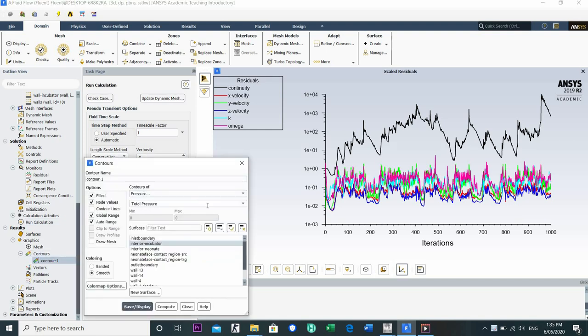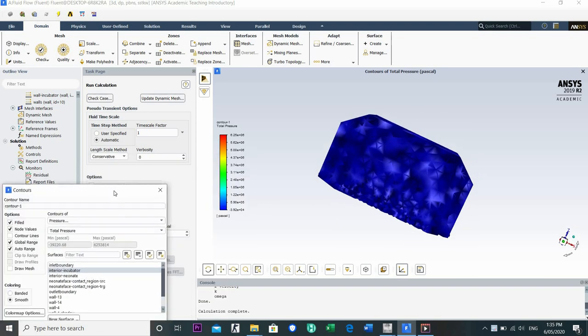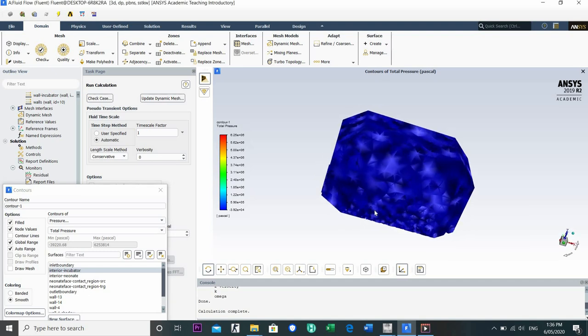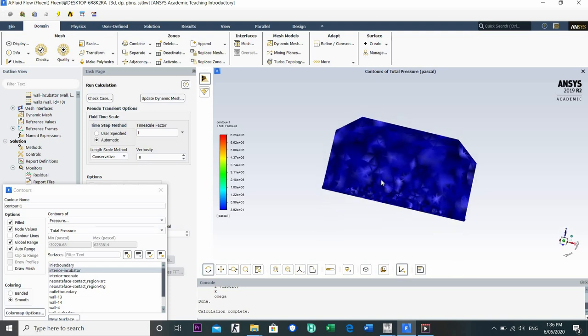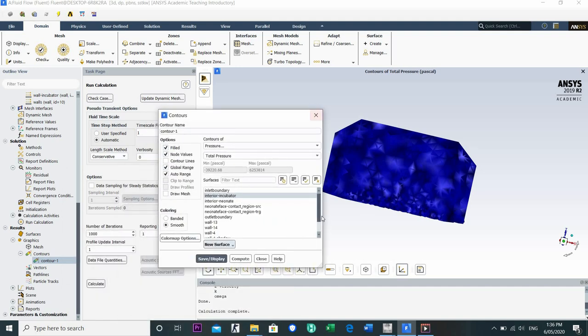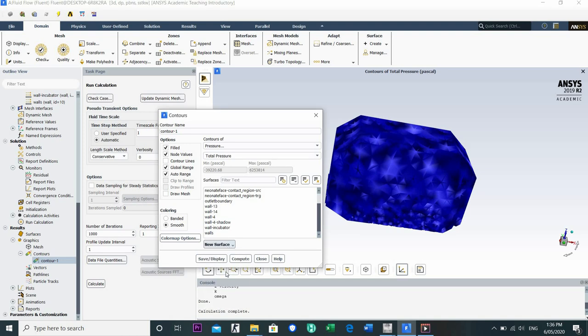Then we can go to the contour. We can check the pressure, and this is total pressure. Then we can display the interior incubator. It looks like this, but actually we have to make a surface for the inlet because it's only at the outside. We need to make a new surface, and it's a plane.